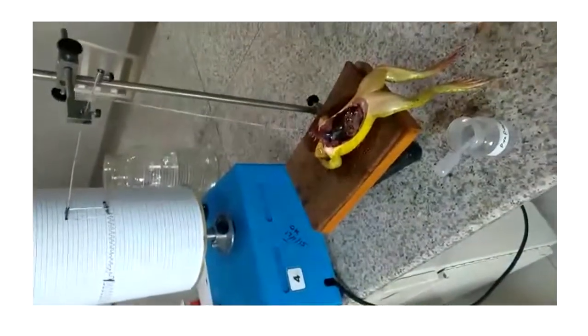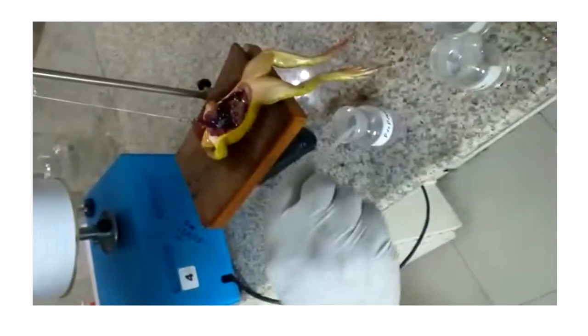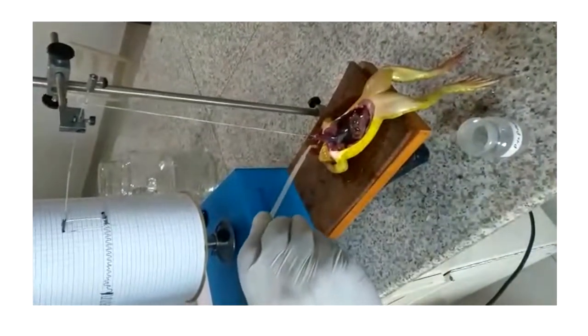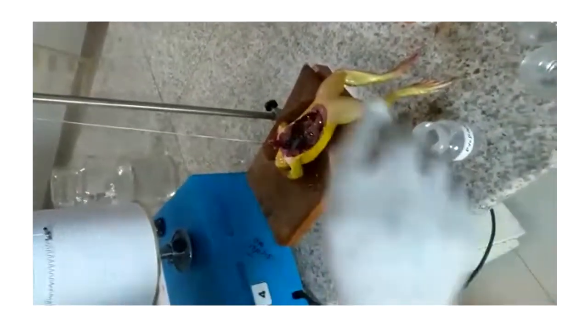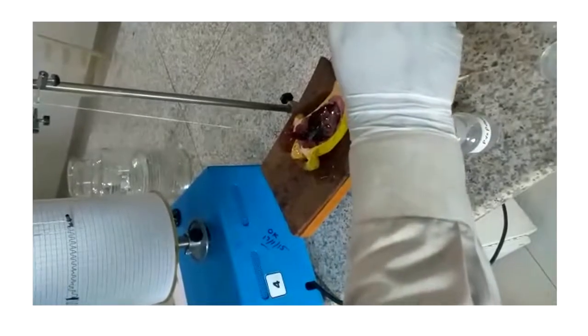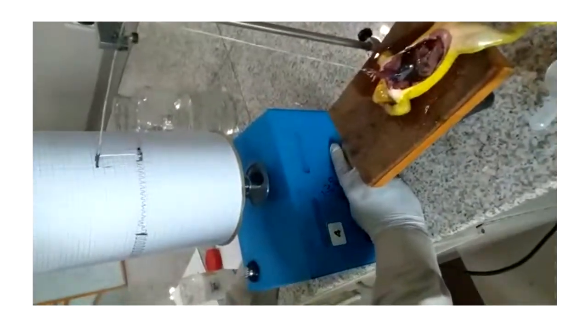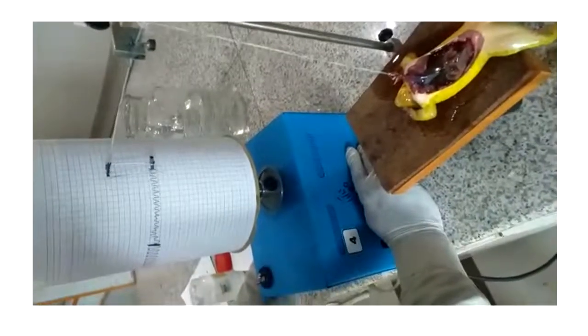Now we will add propranolol. And without washing we will add adrenaline. Okay, start.